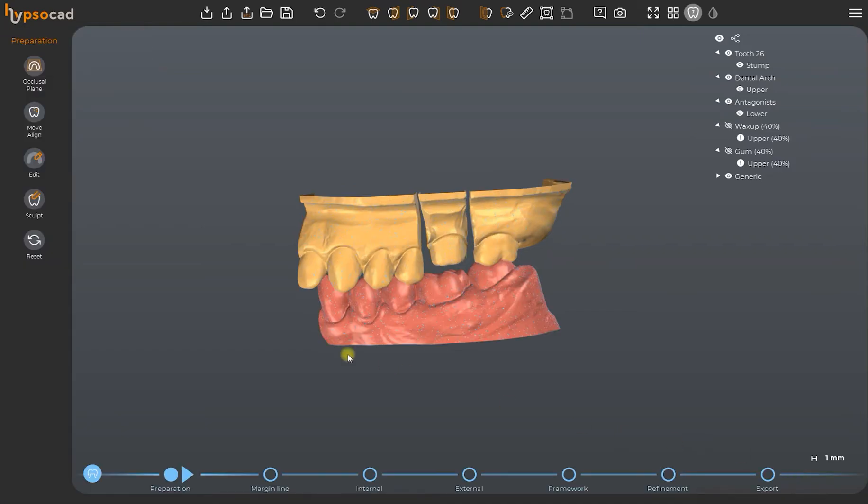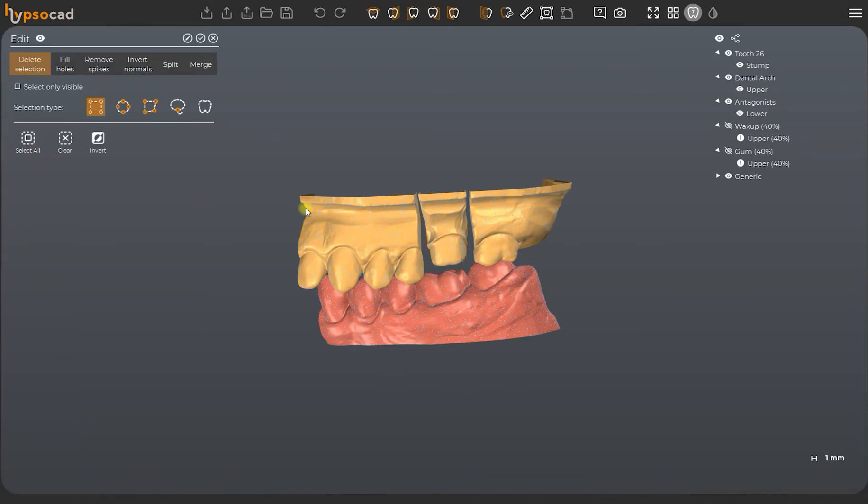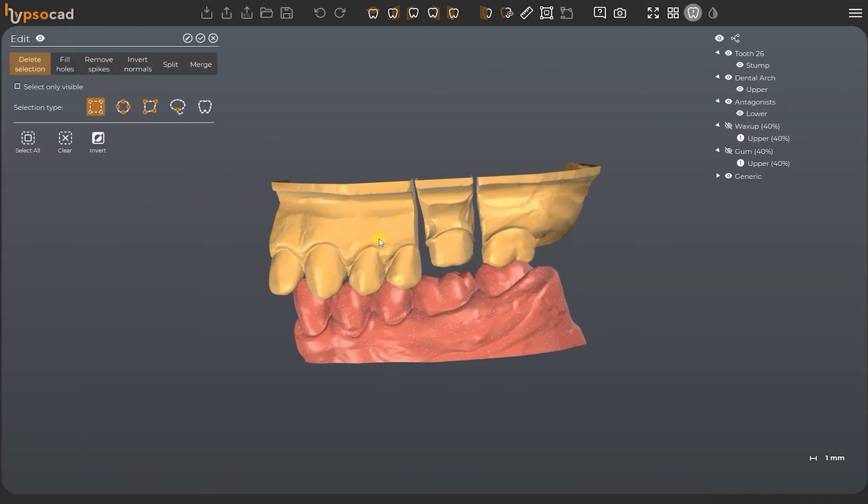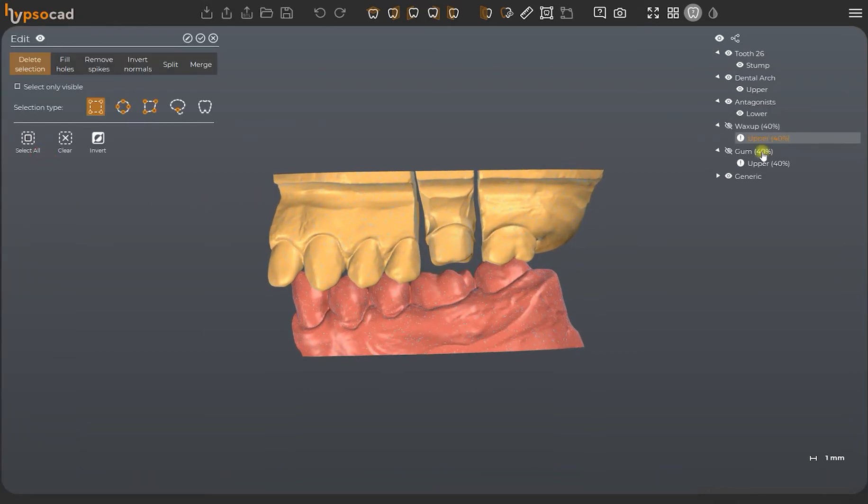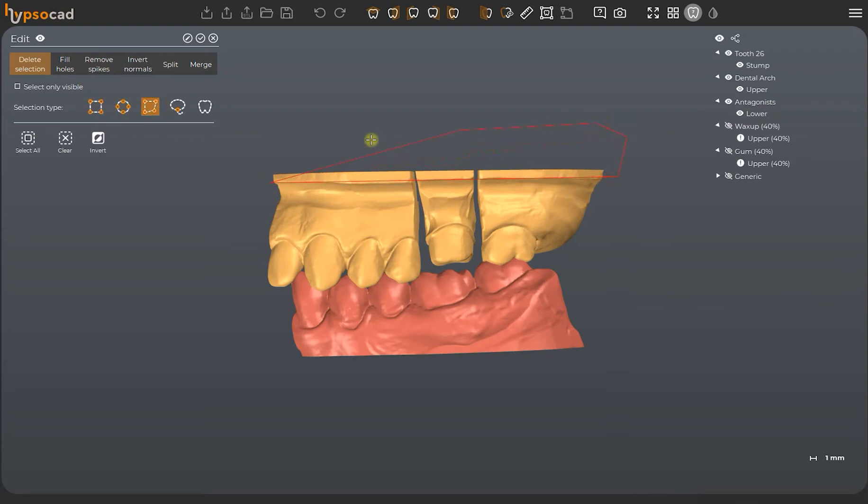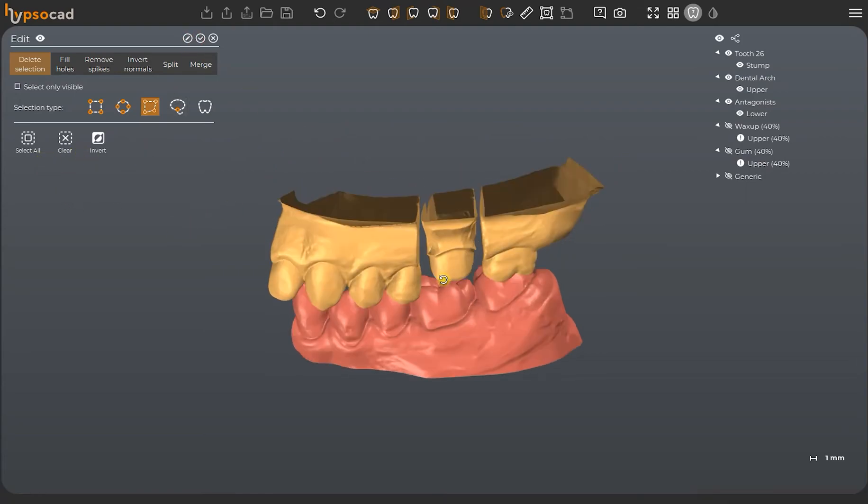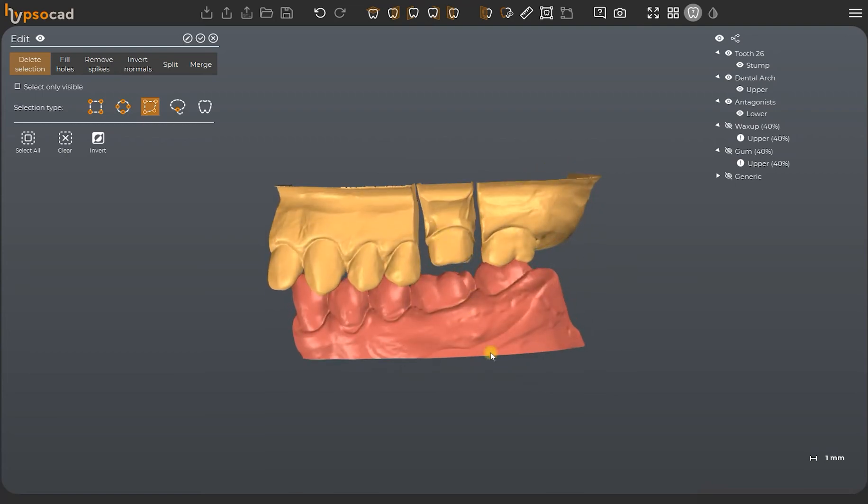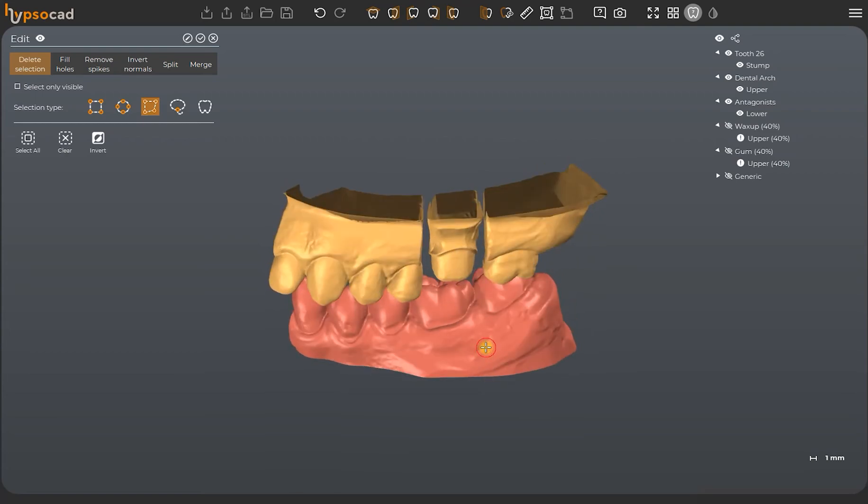With the Edit tool on the menu on the left, it is possible to modify the mesh, delete parts, and close the holes up.